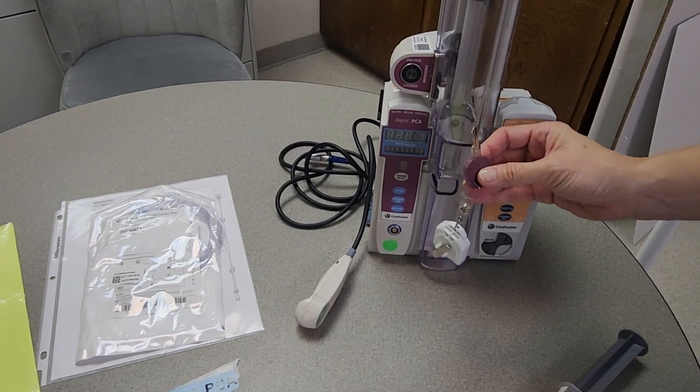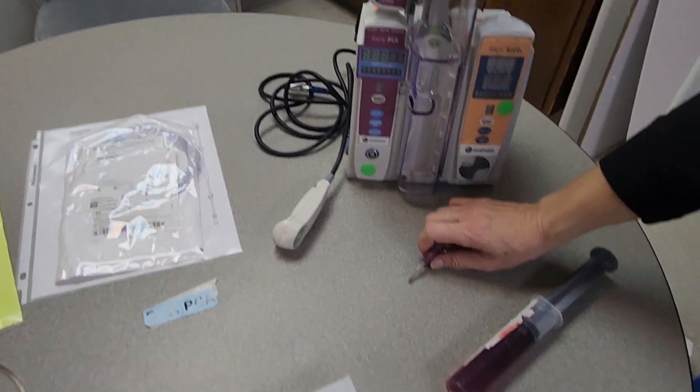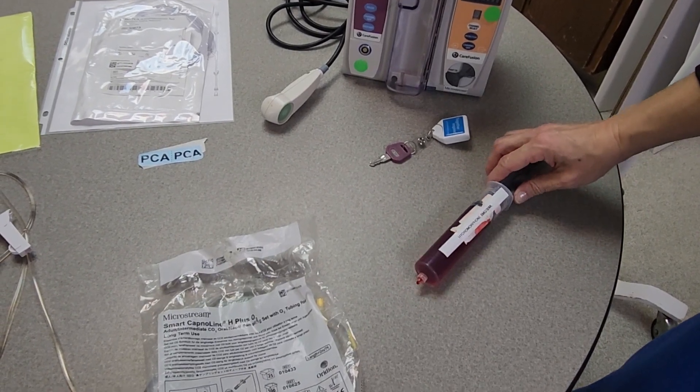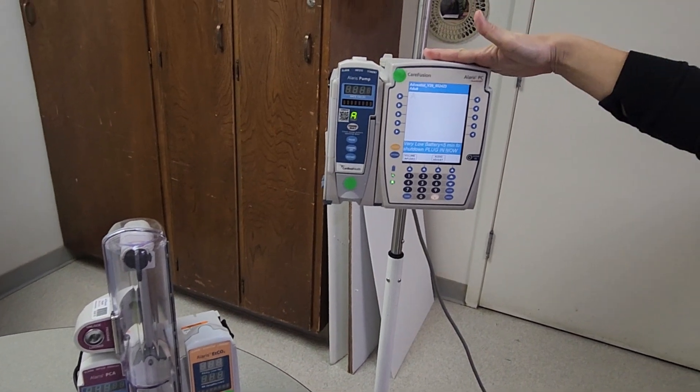The PCA key is stored in the Pixis machine, and the pharmacy will be delivering your medication syringe labeled for you. You will also need a standard IV pump.